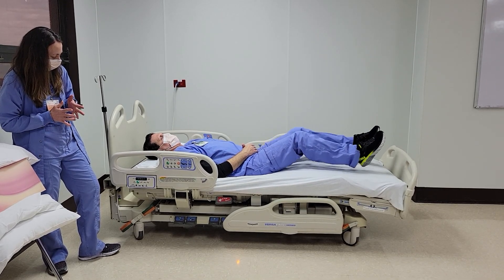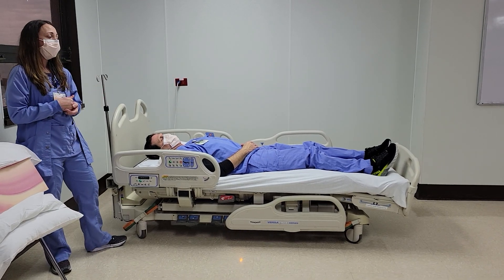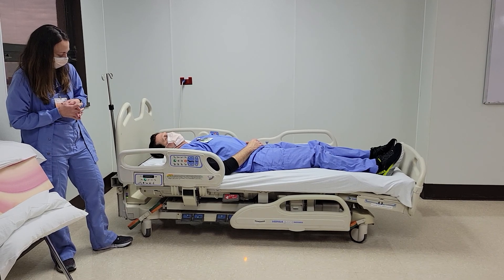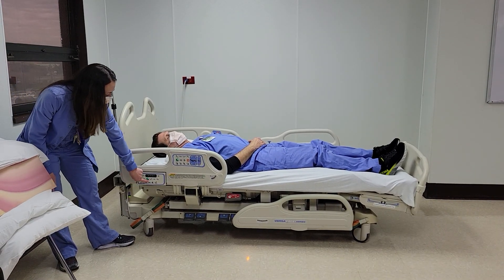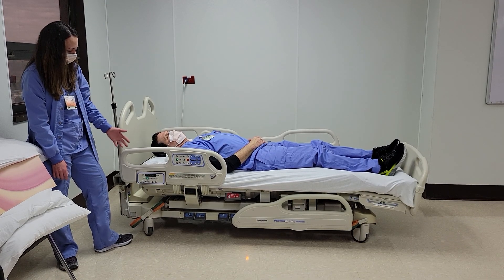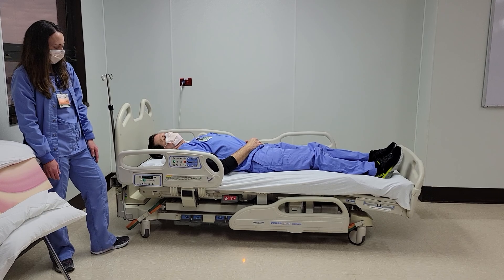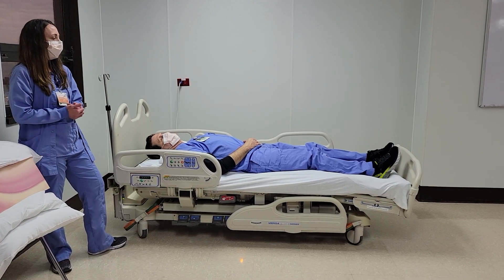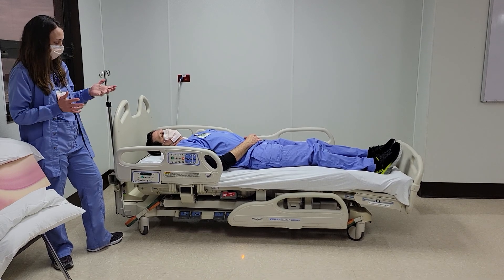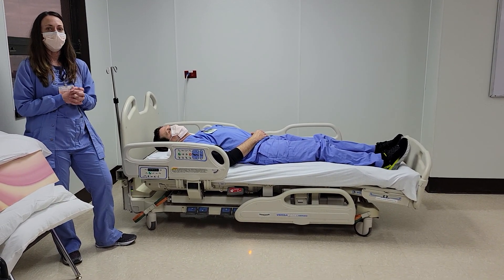Keynotes as far as the bed alarm goes: it works better if you zero out the bed before utilizing the bed alarm buttons. You hit the key and choose which bed alarm you would like to activate. There's also the turn assist if needed. Key points: make sure your bed is always locked before you move the bed or move the patient — just things to check on that you're all aware of, but we're here to remind you.